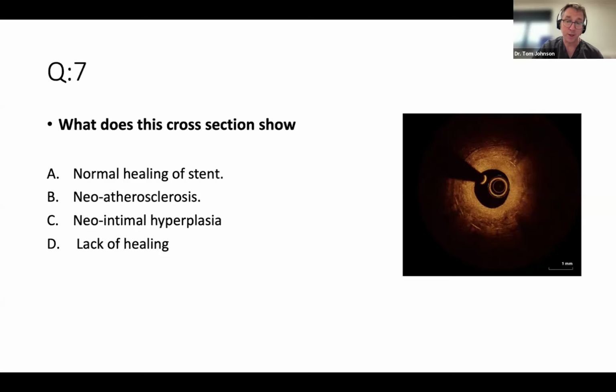So the first thing I'd be doing here, usefully having a stent strut that's evident at 1 and a stent strut that's evident at 7, is immediately making a measurement of the stent diameter, because by far and away the commonest driver for stent failure will be stent under expansion. And when you make measurements of the true vessel size in relationship to that stent, you may well find that the original stent had simply been too small. And that's what's driven the failure.